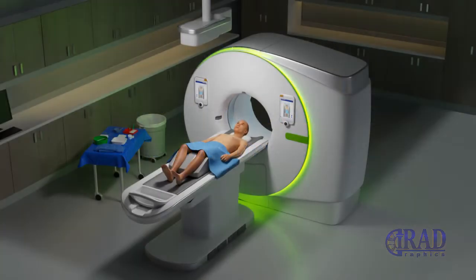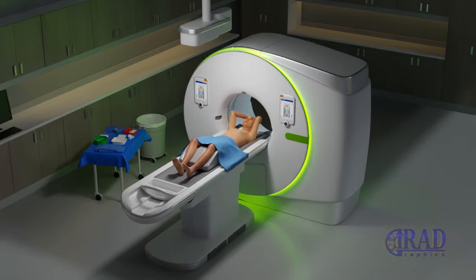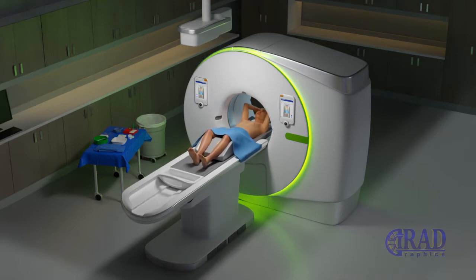Microwave ablation of liver tumors is done under image guidance, commonly under CT guidance. It is most often performed by a specially trained interventional radiologist on an outpatient basis.